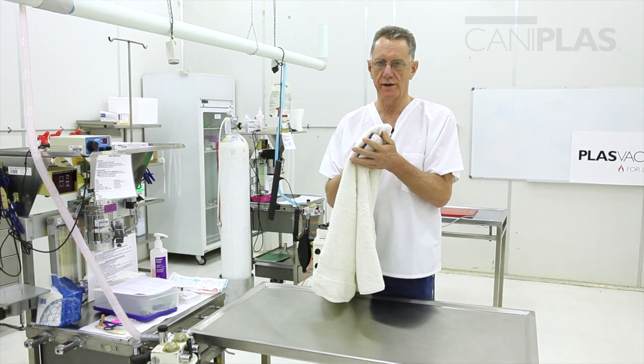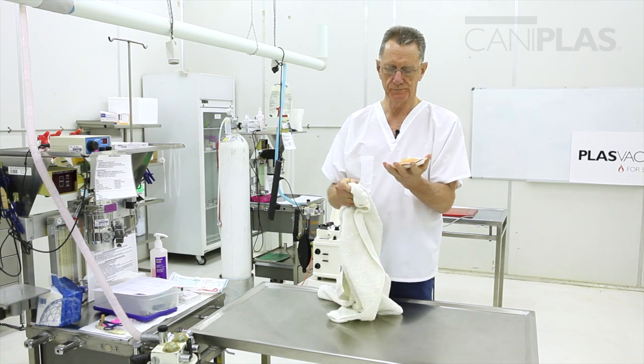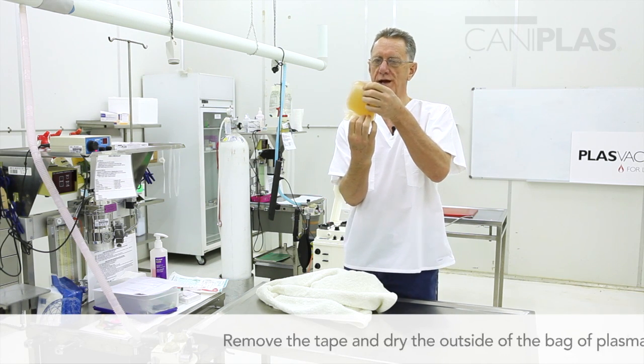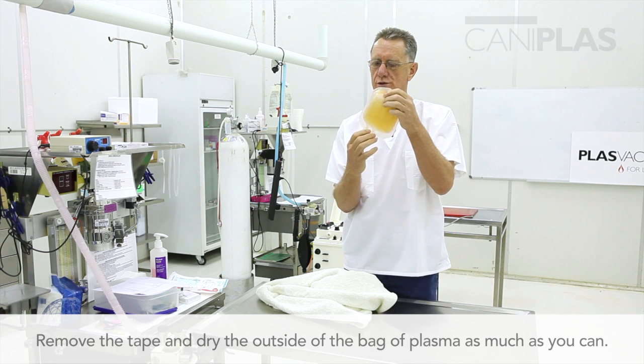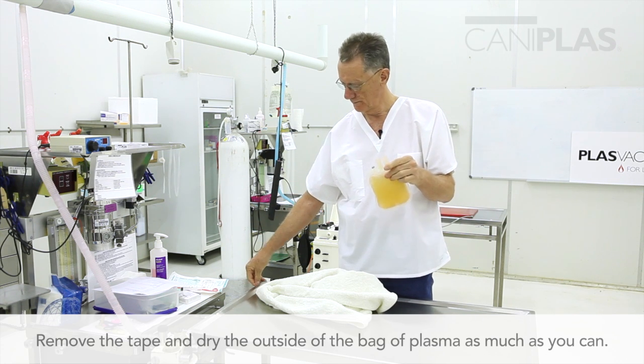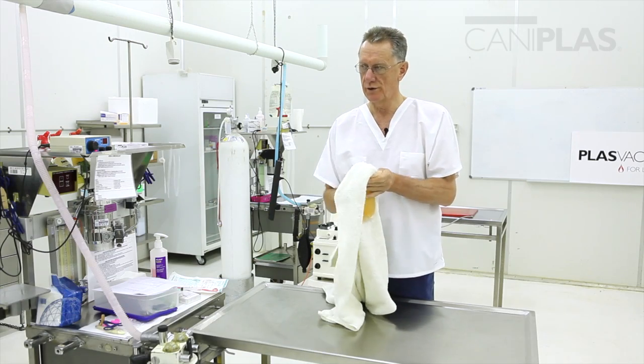It's a good idea to dry the plasma as much as you can. At this point it's quite okay to undo the tape that's holding the transfusion ports on the bag, remove that tape, and continue drying.